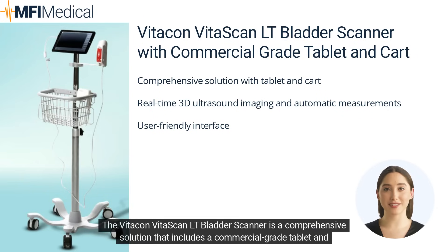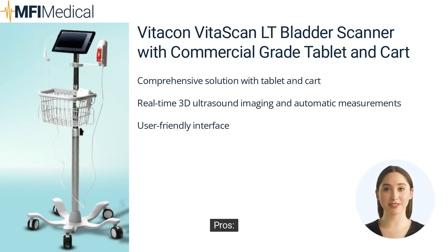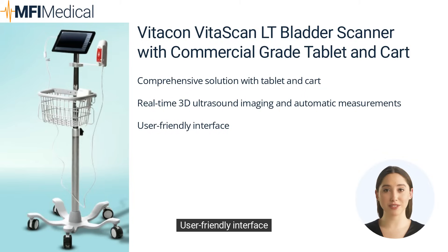The VitaCon VitaScan LT Bladder Scanner is a comprehensive solution that includes a commercial-grade tablet and cart for added convenience. It features real-time 3D ultrasound imaging, automatic bladder volume measurements, and a user-friendly interface. Pros: comprehensive solution with tablet and cart, real-time 3D ultrasound imaging, automatic measurements, and user-friendly interface. Cons: higher price point compared to some models.